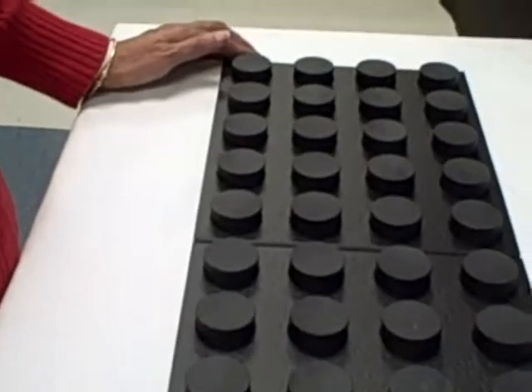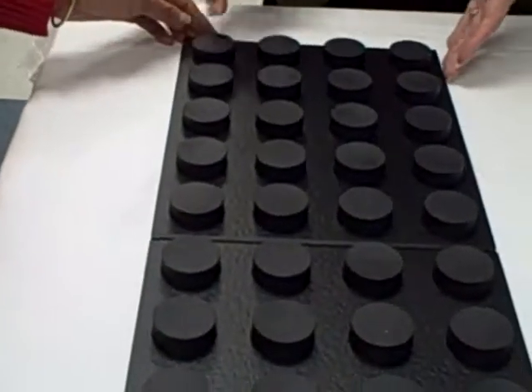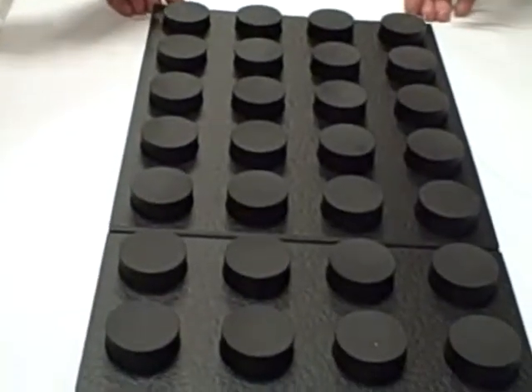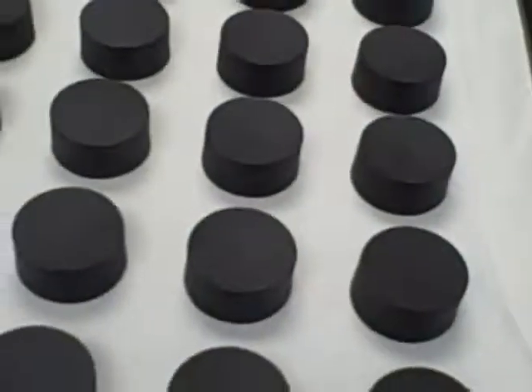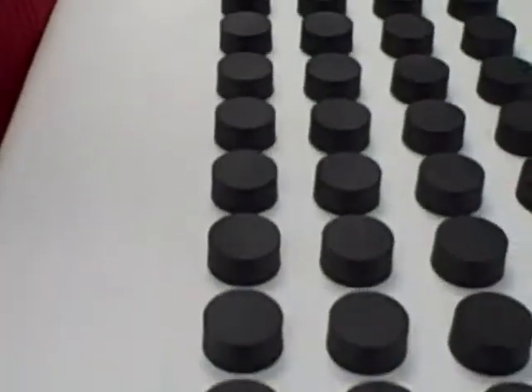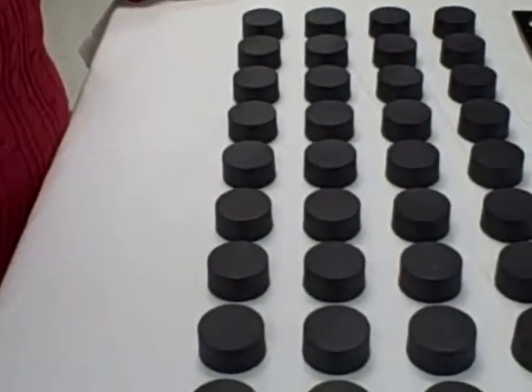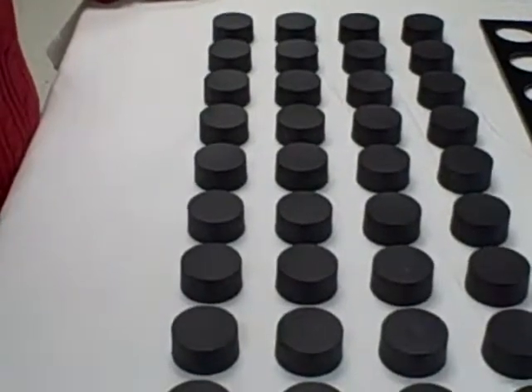The first one is the placing test. So you start by laying this board down and putting all the pieces in it, and then lift the board up carefully and lay it right next to it so that everything is still aligned. You're supposed to read the directions exactly to the client. So the object of this test is to see how fast you can put the blocks back into the holes with one hand.